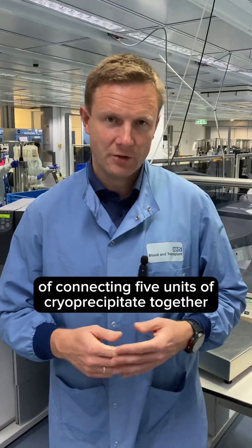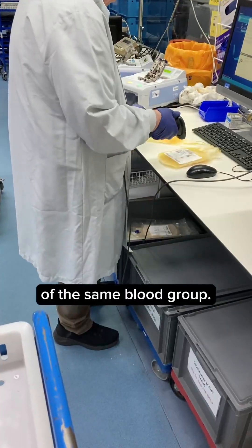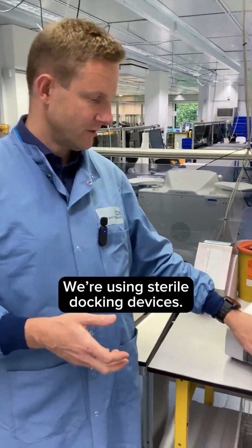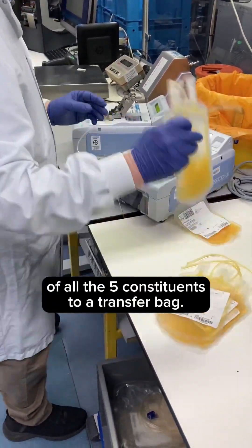Cryoprecipitate pooling is a process of connecting five units of cryoprecipitate together of the same blood group. We're scanning those units into this batch and using sterile docking devices to connect the plastic of five constituents to a transfer bag.